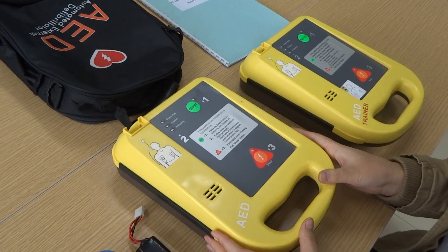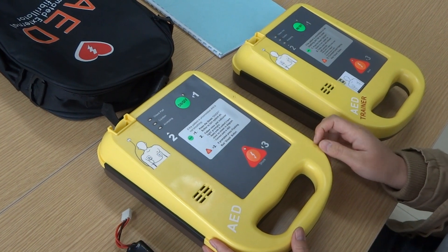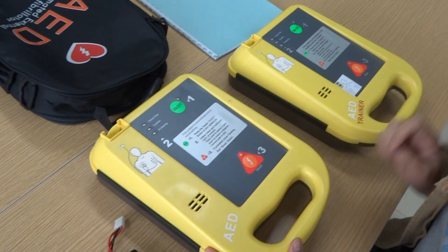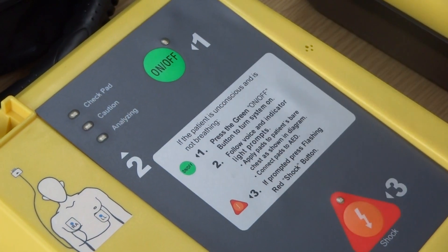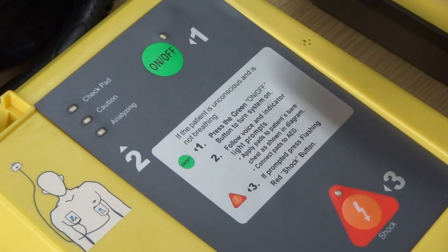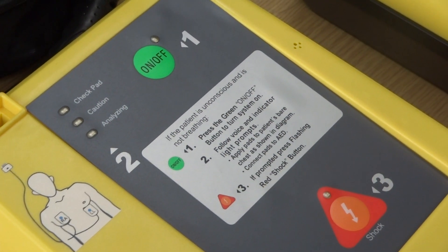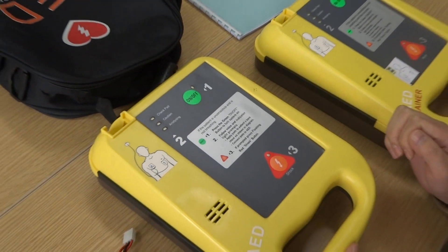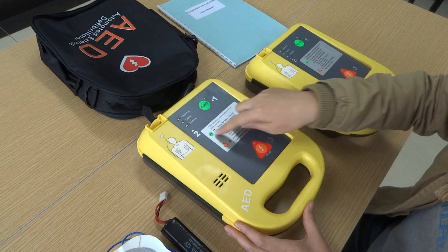This is the hood of the AED. On the main interface, we can see three LED indicator lights and two buttons. One is the green on/off button, and the red one is the shock button. All of our operations will rely on these two buttons, and some tip text.